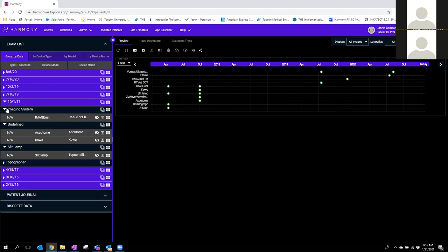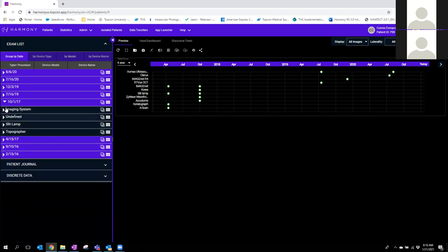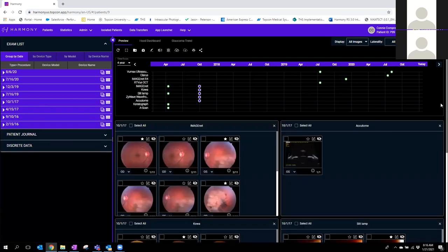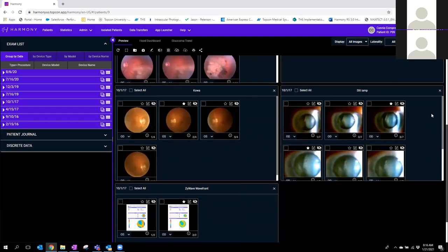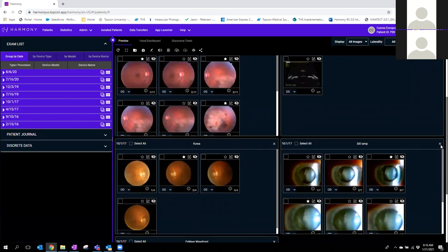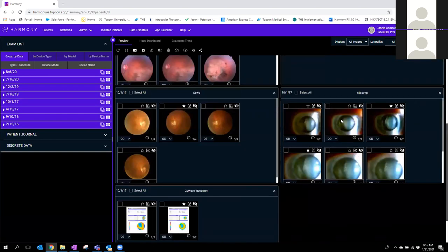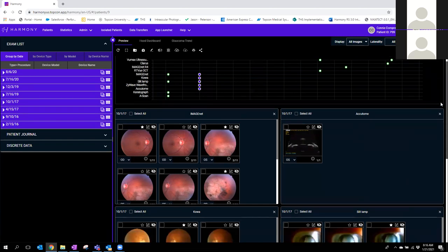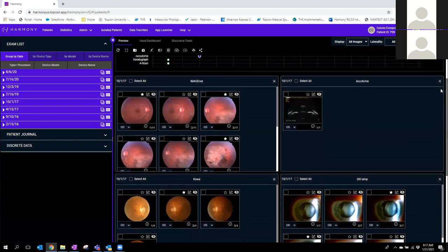If you want to see a quick preview of everything for an entire day without opening sub-menus, come over to the proof sheet icon and click on it. This shows basically every exam or image captured for that particular day. You would log into the patient chart, click on the proof sheet icon, and there you have everything for that day on your right side. Now that we have these thumbnails, let's explain how we can sort things, and then we'll look at them closer up.